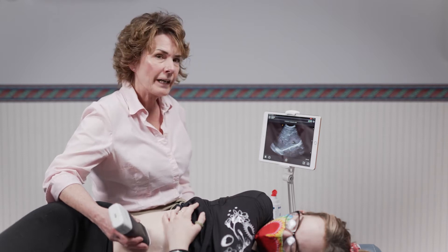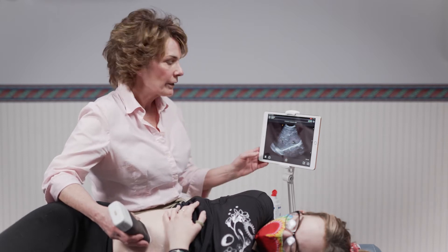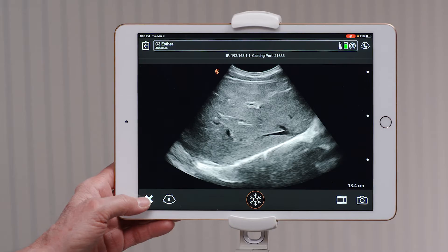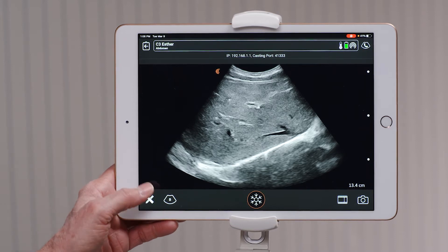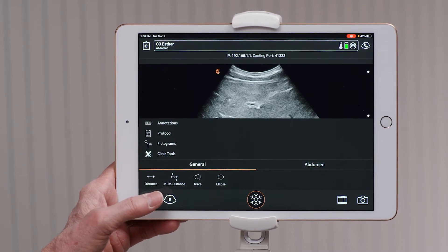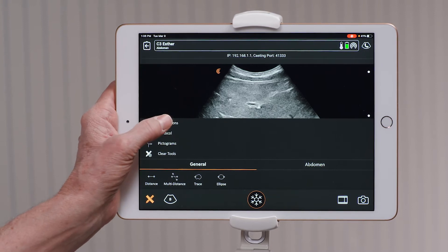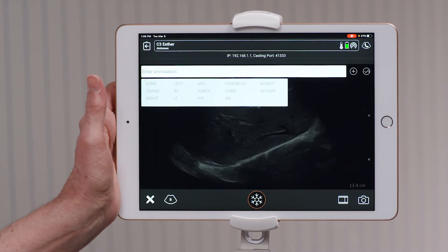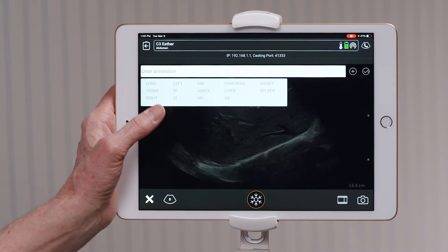To select annotations, you're going to go to the ruler and the pencil in the lower left hand corner. From there, you'll see the annotations. You tap that with your finger and now you can select what you are scanning.